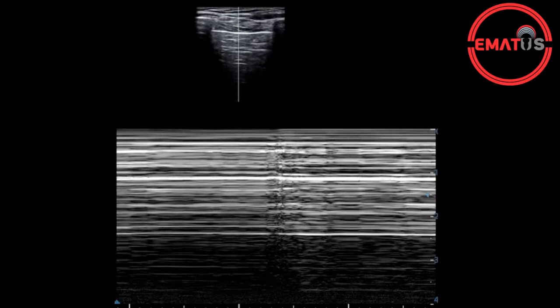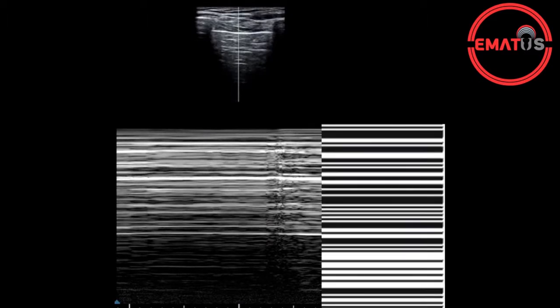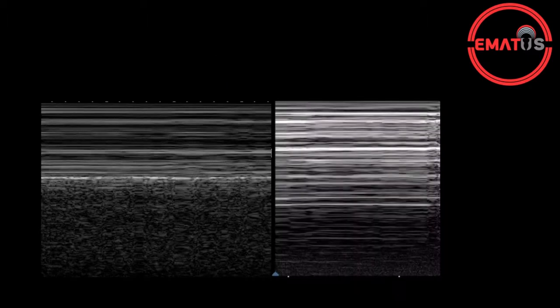In M mode, the seashore sign will give way to a pattern of linear strikes called the barcode or stratosphere sign. Here on the left side, we see the M mode sonographic image of a normal lung with the seashore sign, whereas on the right side, we see the barcode or stratosphere sign in a patient with pneumothorax.